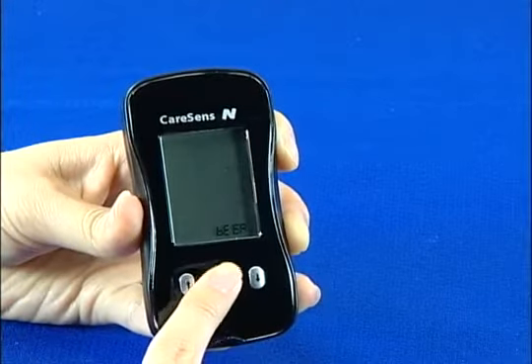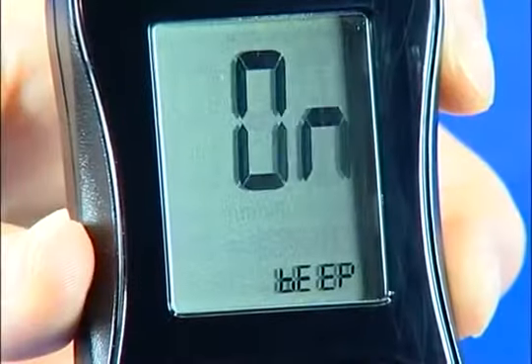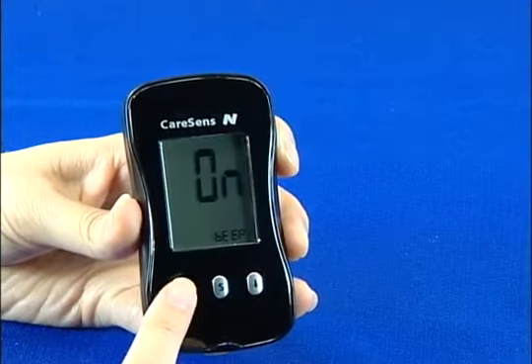After setting the unit, press the S button to turn the beep sound on or off. Use the left or right button to change the setting to on or off.